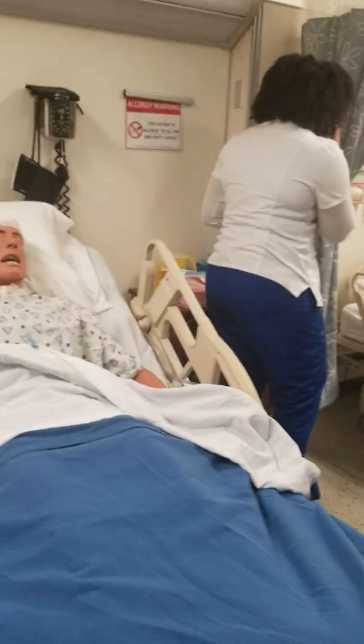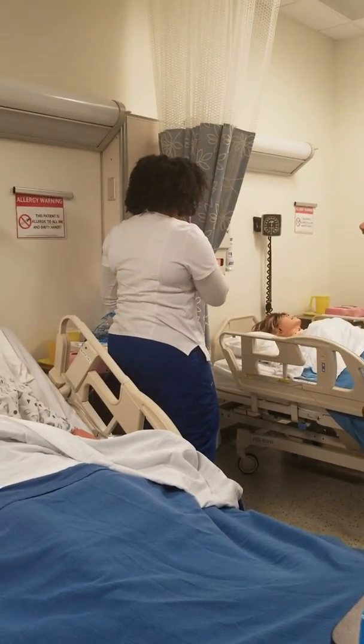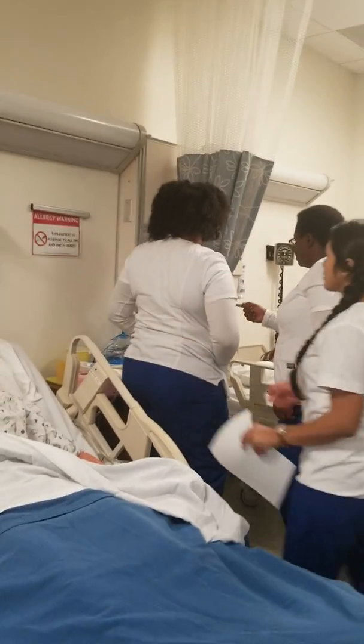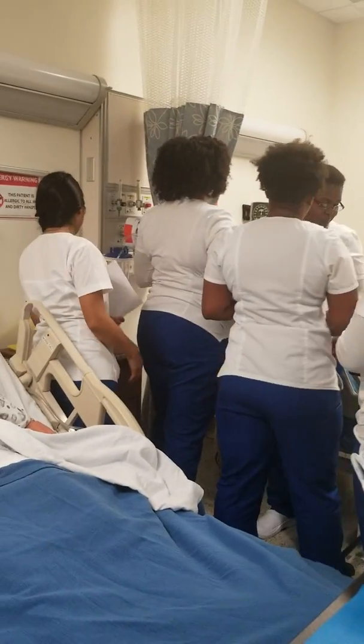Get familiar, because when you see it in a clinical setting, you'll say, I know it's off, it's continuous, and it's intermittent, right? And it tells me. Because they would say, well, how would you know he's on continuous? Duh, I just read it. Nursing is a contact sport. You got to get in there.